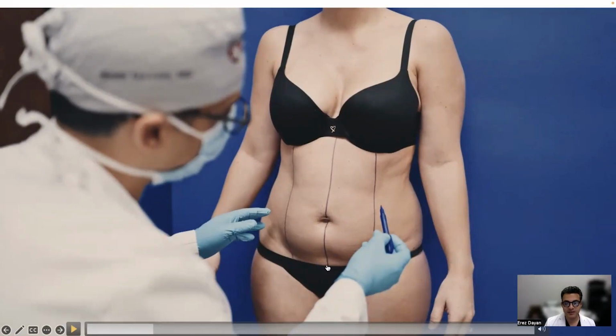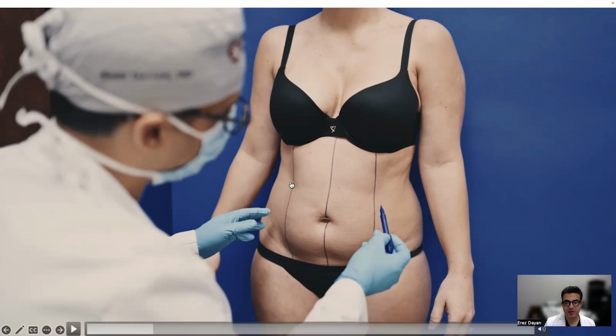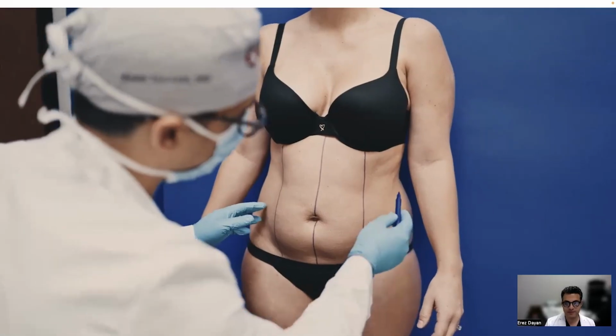I'm going to create one centrally at the base of this line, linea alba, and then I'm going to create one or two in the umbilicus. And the reason I create my access points there is because I can over liposuction these lines a little bit to create a shadow, which will give kind of a medium definition look. With liposuction, as you become more advanced, it's not all about making the skin envelope totally even in thickness. It's about creating shadows. And a great place to create a shadow are the outer parts of the semilunar line, as well as the linea alba line, because the human eye identifies that as kind of muscular borders.